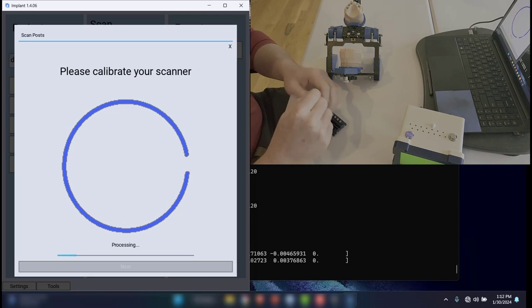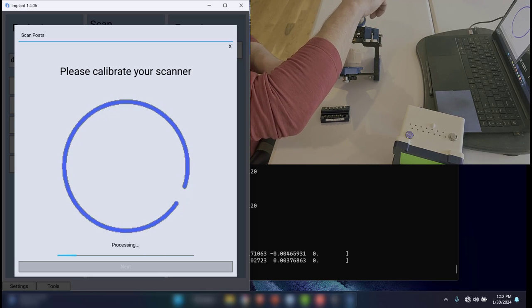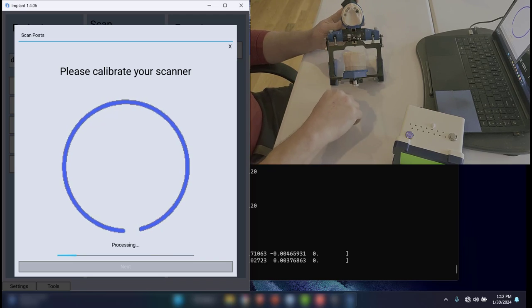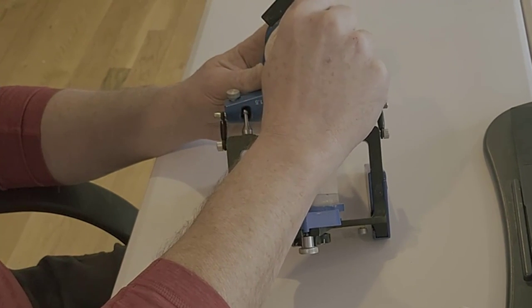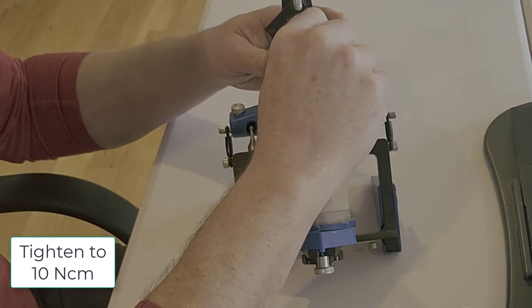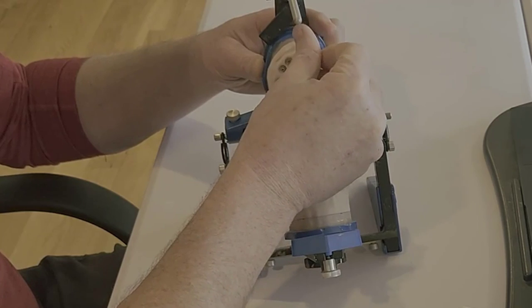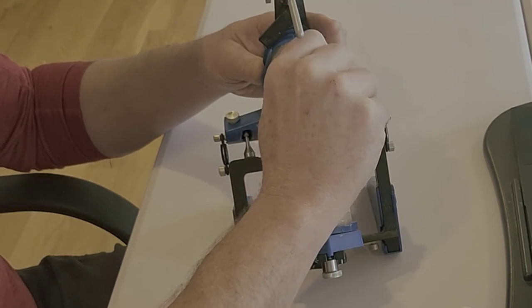All right. Now, in the meantime, I'm going to go ahead and be placing on my photogrammetry scan posts. And so again, you've got 6 of them available to you here. And they are just a cylindrical shape, which makes it really easy to grab them by hand and just tighten them on with finger pressure. You're not looking to put tons of torque on this. I'm going off memory, but the instructions indicate to do this with right around, I think, 10 Newton centimeters of force. And so what I would tell you is just go like 2 finger tight, kind of like you would a cover screw. You don't want a cover screw to get stuck on there.